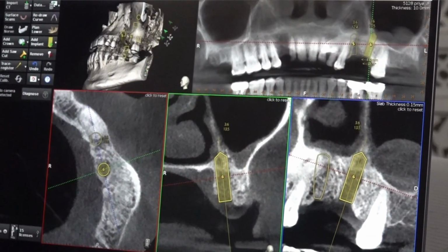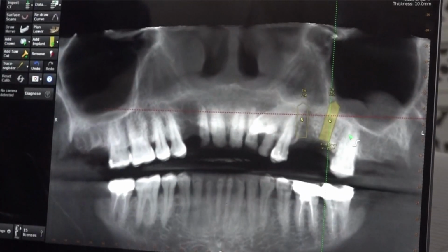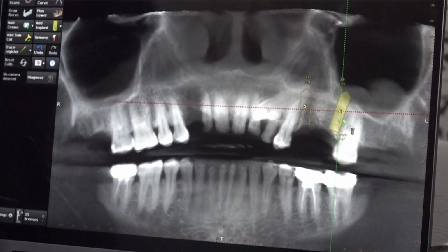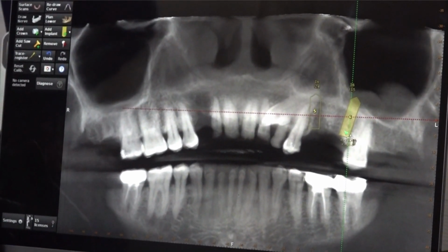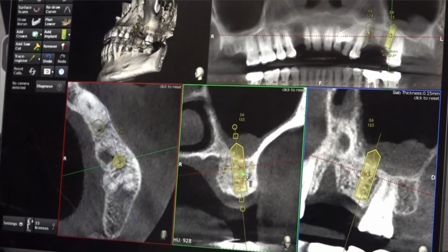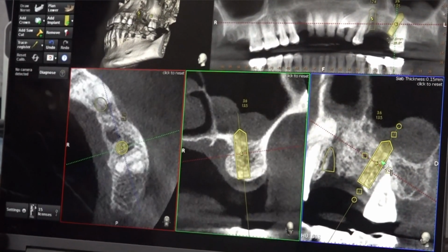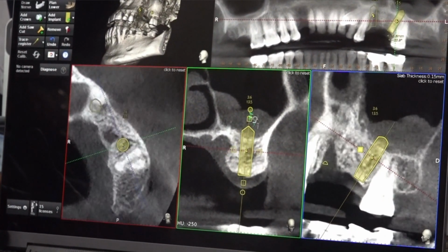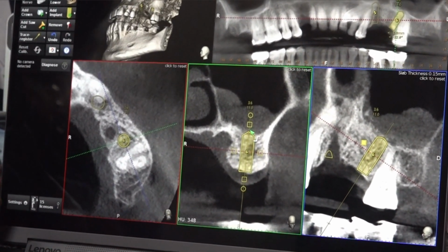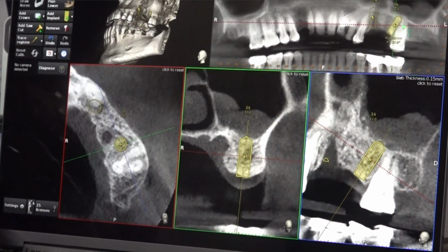But one more option is also there. This is 7, right? The molar is 7. Just behind the palatal root and just in front of the 7 root, you will have good bone. Can you see? You have to tilt distally. If you see, the bone is very good. Buccolingually very wide. Height also is around 11 mm. The only thing is you have to tilt it distally.